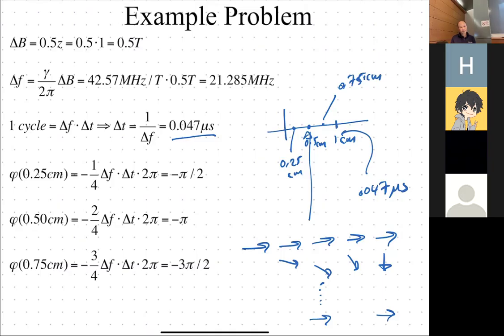The rate, but I don't understand what rate we're talking about? So if you have an object here, let's say I have different voxels. This one experiences some B naught field, and maybe I go here and it experiences B naught plus some delta B. You could just assume whatever the average delta B is here.